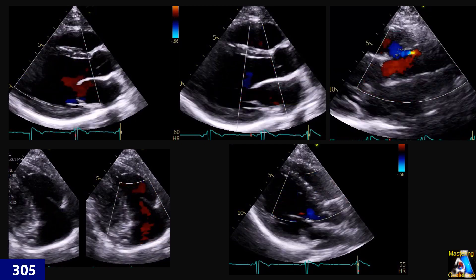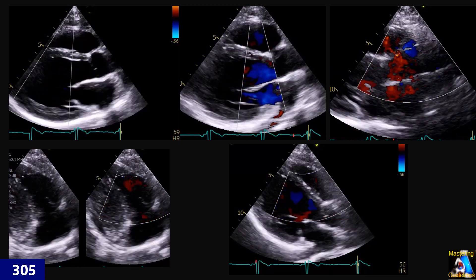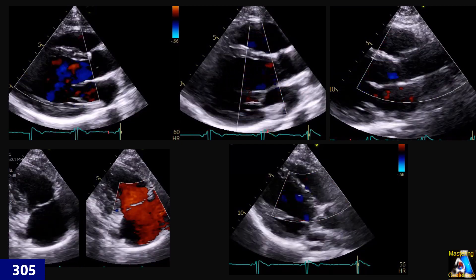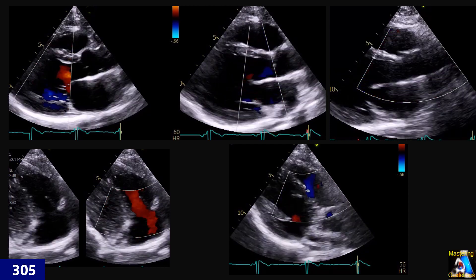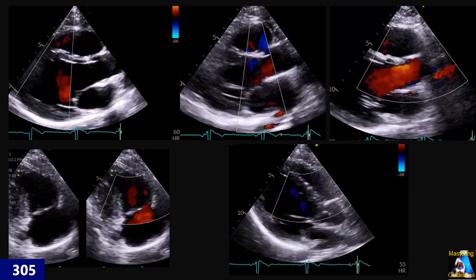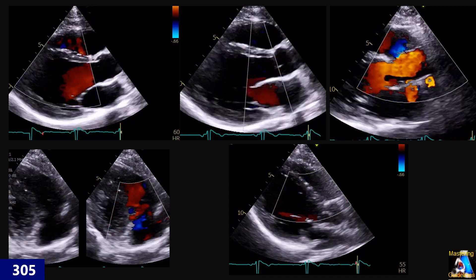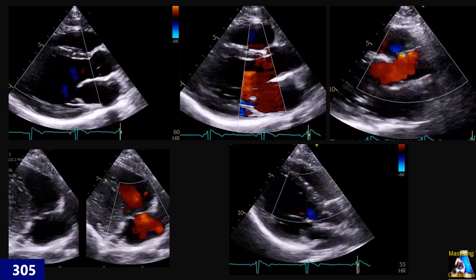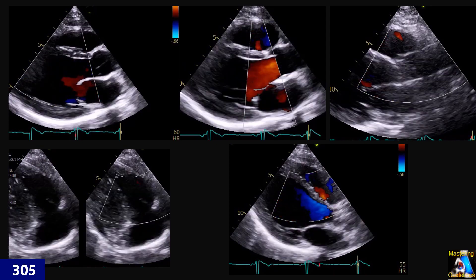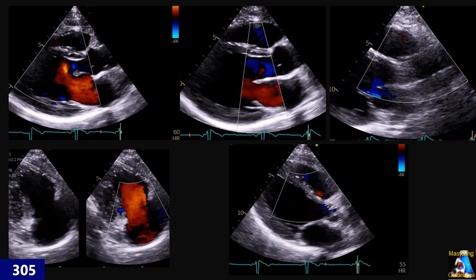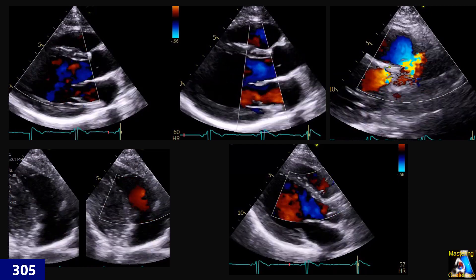We have a patient, a 21-year-old male. The reason for indication was palpitations and some abnormal EKG on Holter monitoring for two weeks. When I asked the patient a little history, it showed up that the patient has some congenital murmur — he remembered that they called it in childhood. They told him he has a murmur, and the childhood echo was normal and they couldn't find any reason for it. Anyway, the patient indication was palpitation.